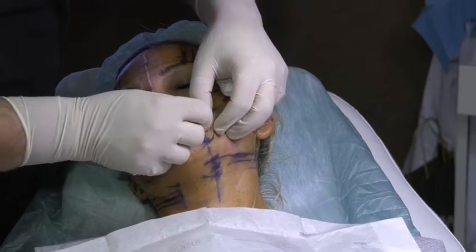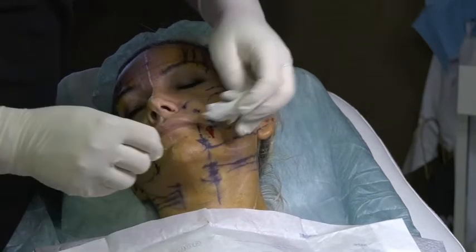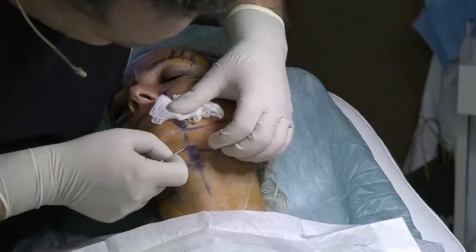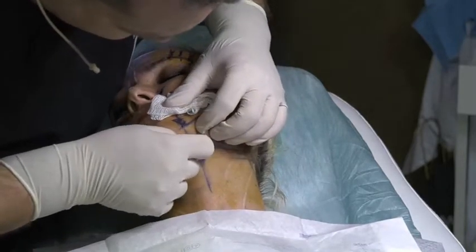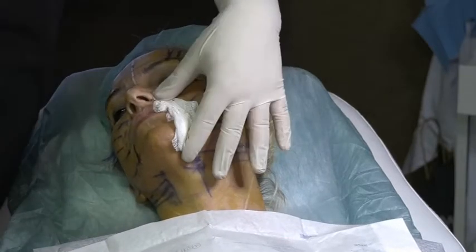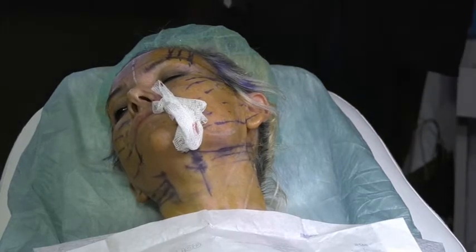30-degree angle. And if you have blood, you can compress. Okay? 30-degree angle, this is my last thread. So I finish one side of the face, I will compress all, and then I put my threads. So I keep this one here now.